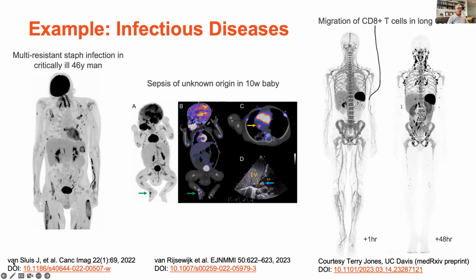And you might be able to notice there seems to be elevated uptake in the bone marrow, and compared with their control group, this was significantly elevated uptake. There's obviously a lot of uptake in the spleen as well. And this image 48 hours later shows the signal having changed, indicating that the T cells have trafficked away from the bone marrow.